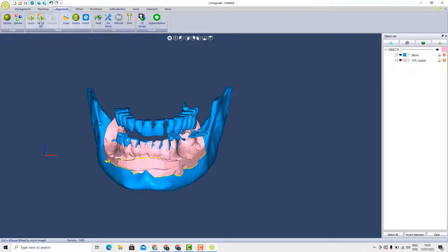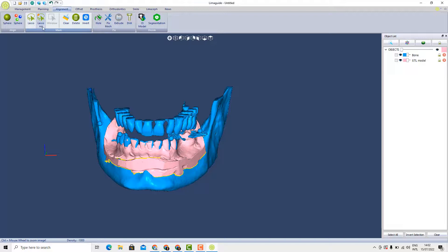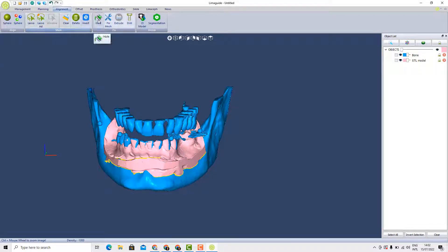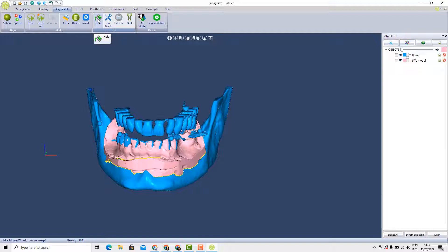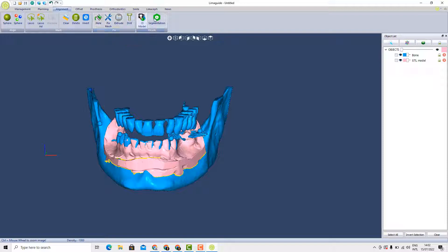Another tool is the lasso. This tool is to cut a mesh. The hole is to fill or close any hole that we have in our models. Extrude is to extrude a model to prepare it to be printed. Drill is to create holes inside the model. Segmentation is to segment a tooth from the jaw.